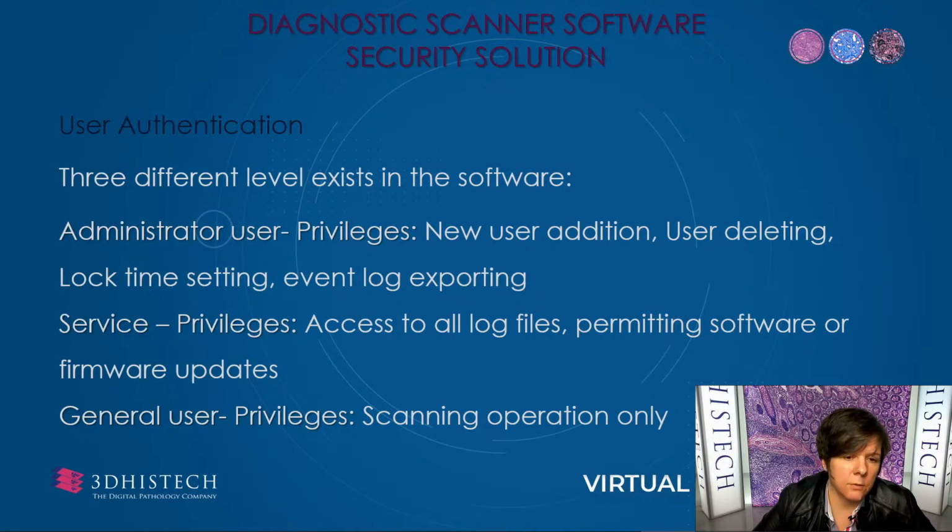The software uses an automatic time method to terminate sessions within the system where appropriate for the user environment. The software employs a layered authorization model by assigning different privileges based on the user role. So the software has three different privileges.